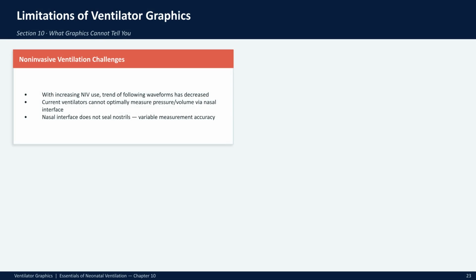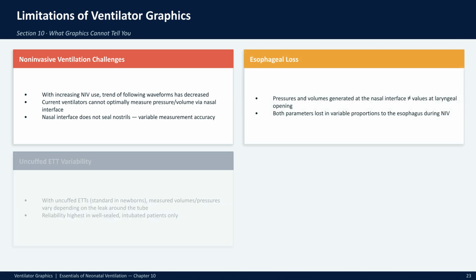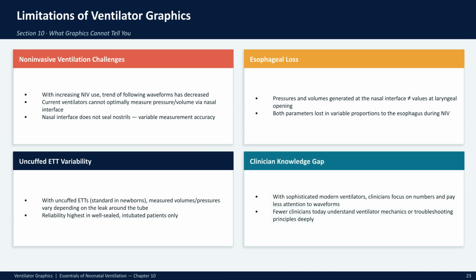Despite the value of ventilator graphics, they have limitations. Non-invasive ventilation often suffers from variable measurement accuracy due to interface leaks, and esophageal pressure loss during these procedures can further obscure the true data. Furthermore, reliance on numbers over waveforms can create a knowledge gap in clinical practice.